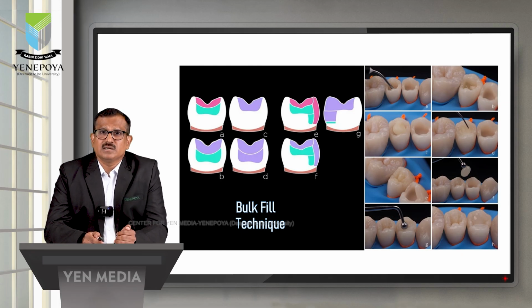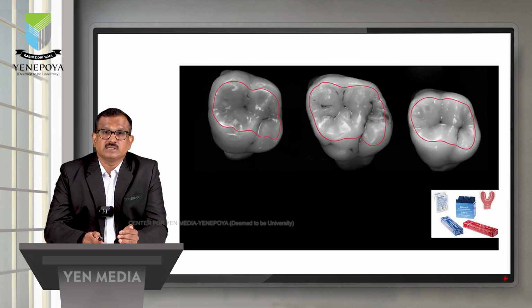But later, if it is for the long term, then I would prefer you to go for the centripetal and then the selective cusp build-up techniques. That will give you better aesthetics.